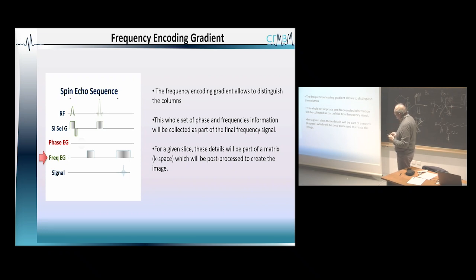And so people are using this word, the K-space. The K-space will be the entire signal in terms of frequencies and in terms of phase of the signals, okay? The K-space will contain all the information, and if you do a double Fourier transformation of the K-space, you should go back to the image because now you've got the information you were missing.